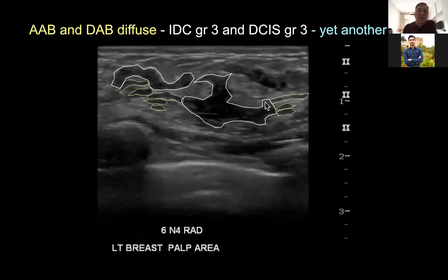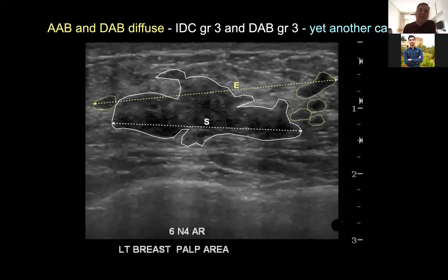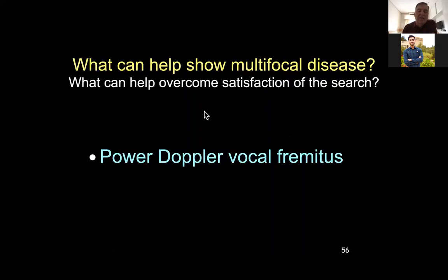This one is grossly enlarged ducts, big difference between size and extent. Again, grossly enlarged ducts. This is a classical HER2 appearance. Giant, wider than tall lesion, often with casting calcifications and really grossly enlarged ducts, often again containing casting calcifications.